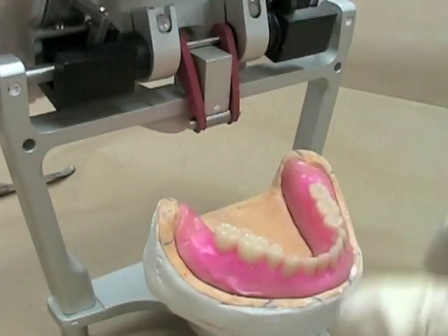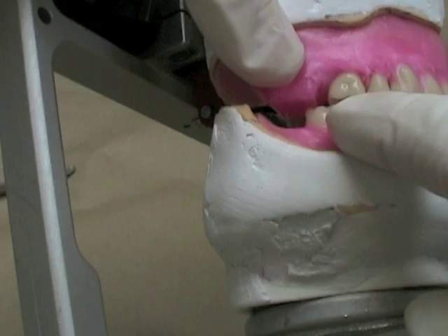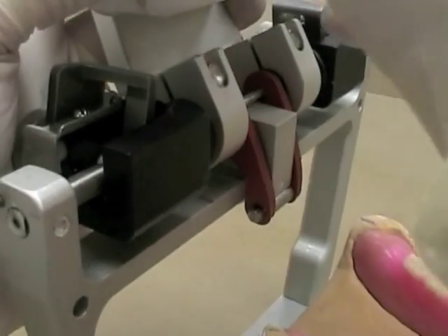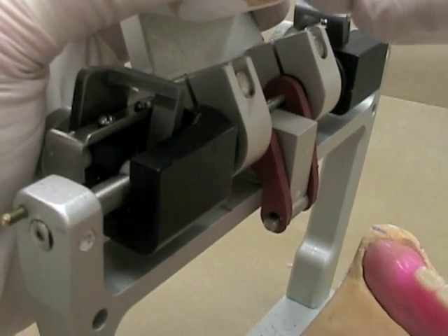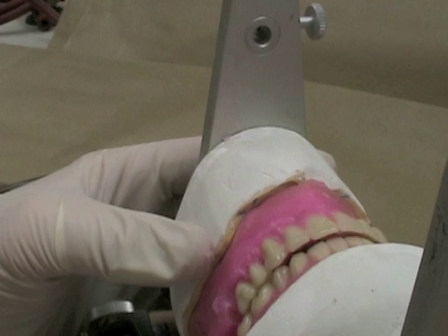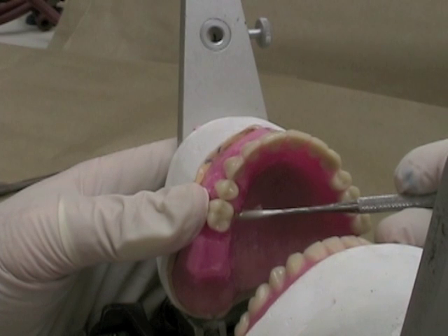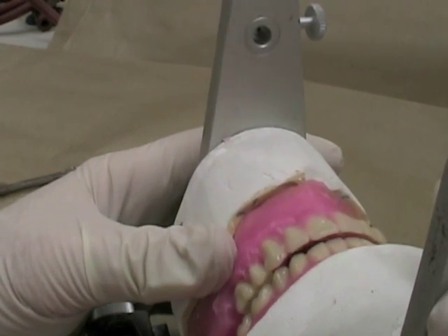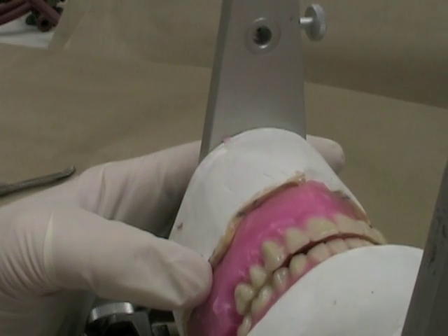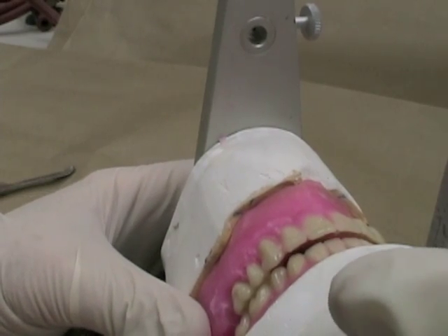I'm going to put that back on and check that against the occlusion in my mandibular molars. Perhaps I'm a little bit shy there on the distal cusp, so I'm not going to put quite as much distal tilt on that. I'll put that back in place and move it out so that I have a little bit more overjet. As you move it buccally the lingual cusp becomes more prominent and you start to get more overjet. Remember you don't want any contact in these areas — you want at least a millimeter of space between the maxillary and mandibular teeth.